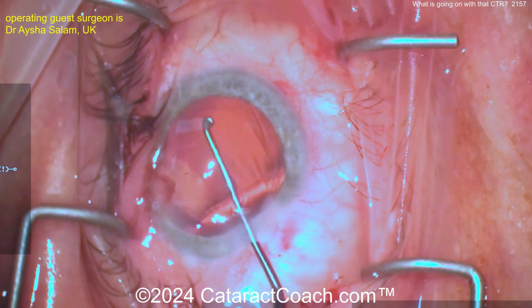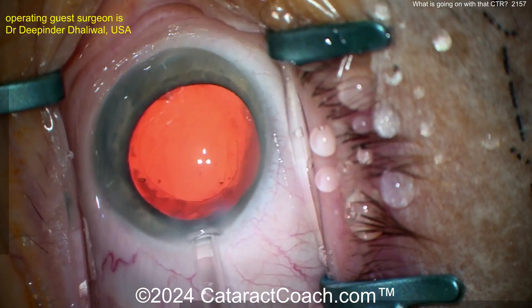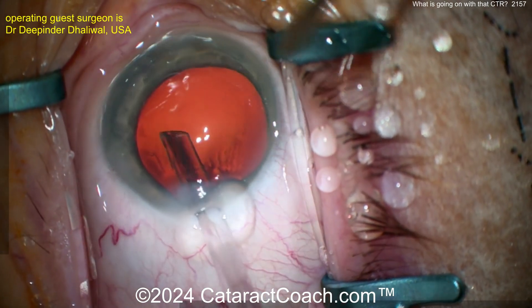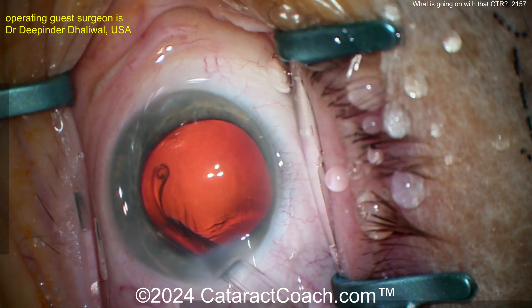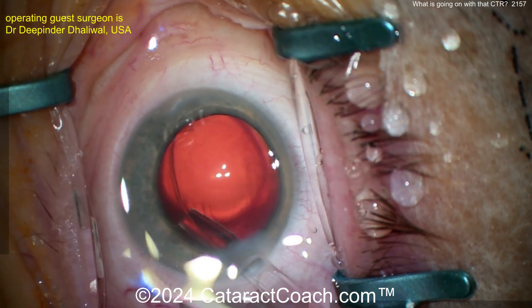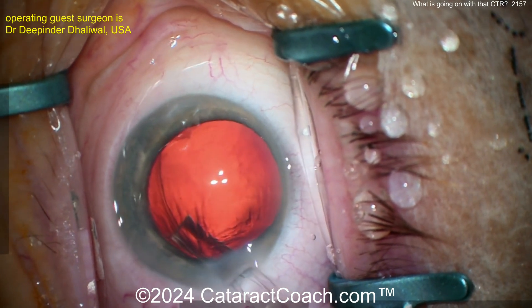That was a very stressful situation. Let's show you Dr. Deep Indu Dolly Wall demonstrating how to put the CTR. Look at this — going into the eye, cranking it way over towards the left side so it comes out very tangential. And now look, it wants to curve around. See how she does that — beautifully done.